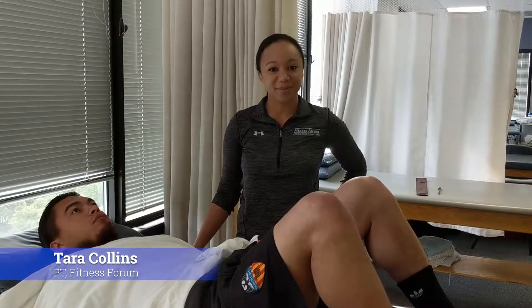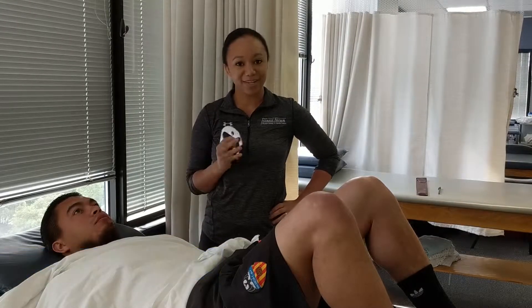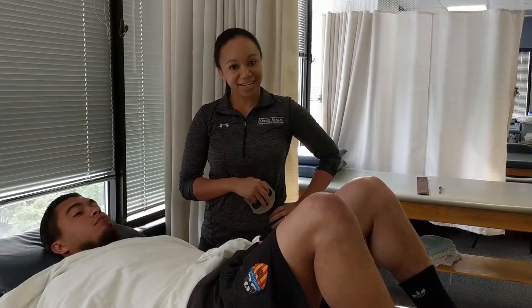Hi, I'm Tara Collins. I'm a physical therapist here at Fitness Forum Physical Therapy in Annapolis. I just wanted to show you guys a little bit about instrument assisted soft tissue mobilization that I am certified in.